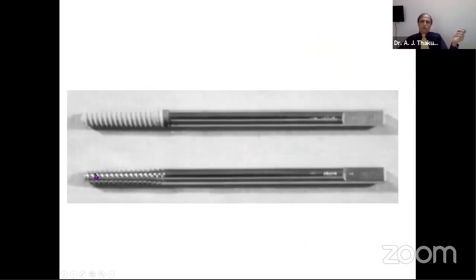Here is a tapered screw which will engage only in the far cortex. You can see the diameter here is less. Here it is more, so it will have a radial press fit. To improve that, the threads could be coated with hydroxyapatite. In an event that one wants to keep for about 4 to 6 weeks or even longer, then one could use the hydroxyapatite coated screws, and that definitely improves the hold. In an osteoporotic bone also it is worth trying.